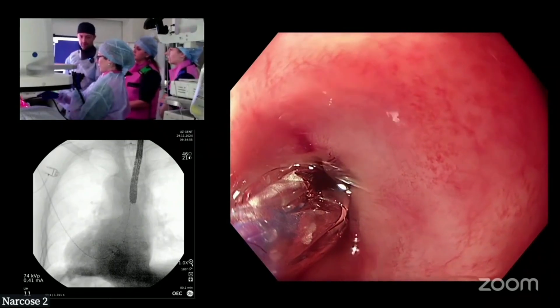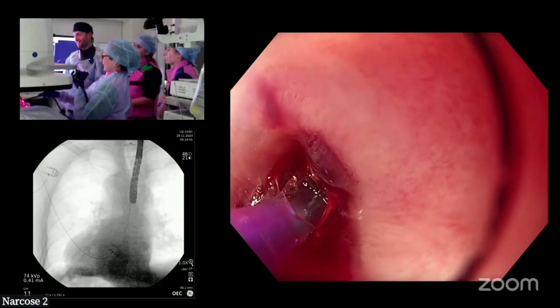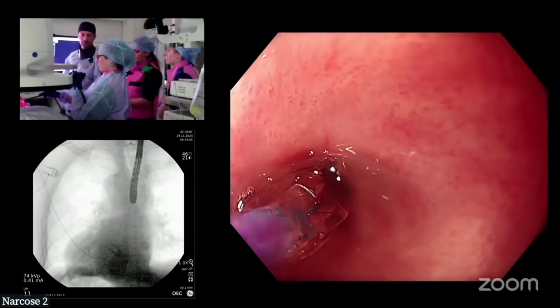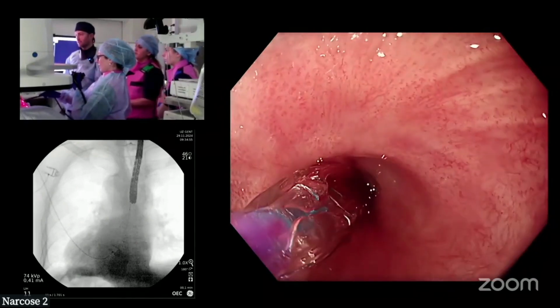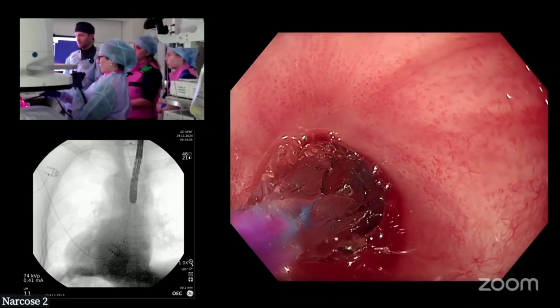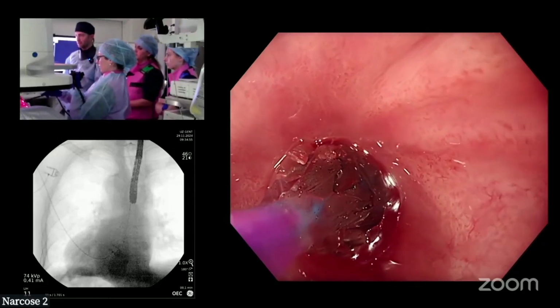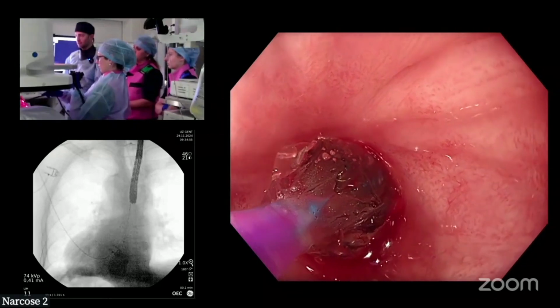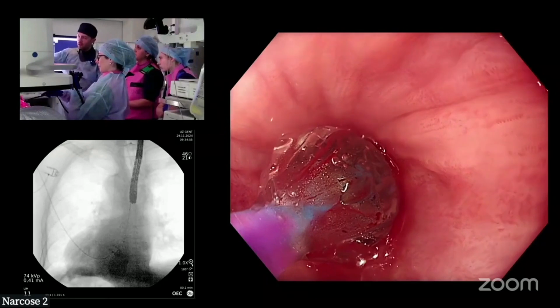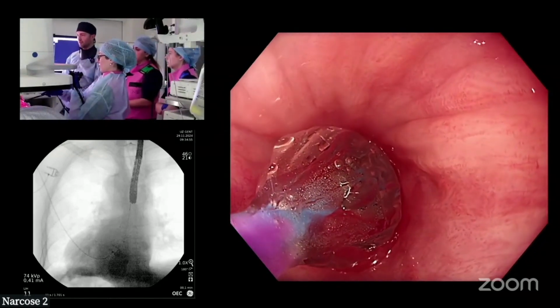All right. So it's pulled you in. So down. Okay, so come back a little bit more. We're going to have to do it in 2 parts, no problem, all right? Suction the fluid if you can. Okay, good. Now, try again. I would pull out a little bit now to stop it pulling you in later, because you only got 2 pumps and you can pull safely. Pull a little bit more. Now, stop, stop, stop. Now you see that just emerged a little bit like that. Now I think it's not going to pull you in, okay? All right. So now I would suggest that you ask her to put a few more pumps in to get it stable.